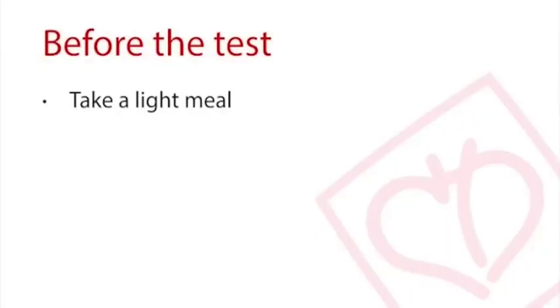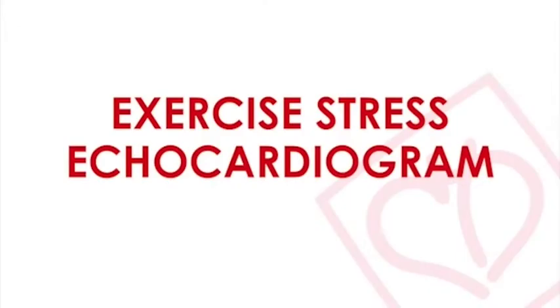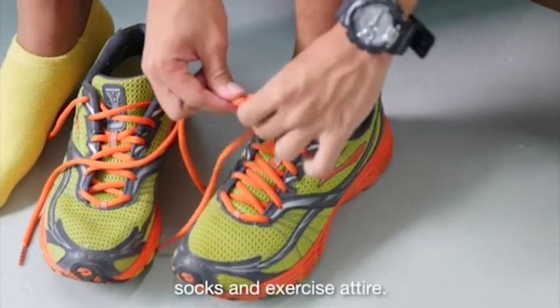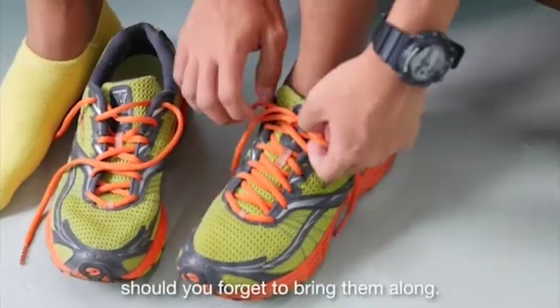You are advised to take a light meal before the test. Remember to also check with your doctor if you need to stop any of your medication before the test. If you are scheduled for an exercise stress echocardiogram test, you will also need to bring along your running shoes, socks, and exercise attire. Socks are available for purchase should you forget to bring them along.